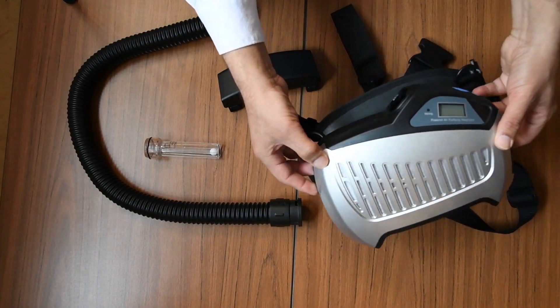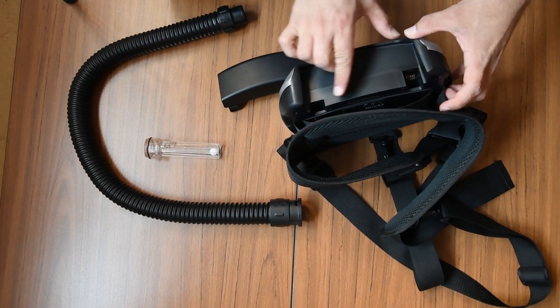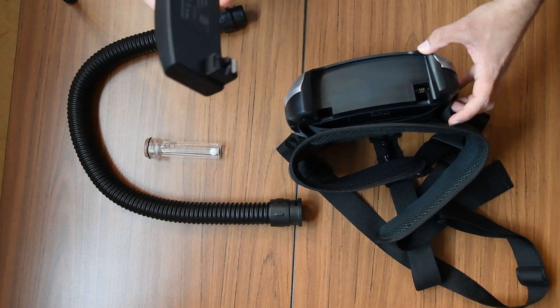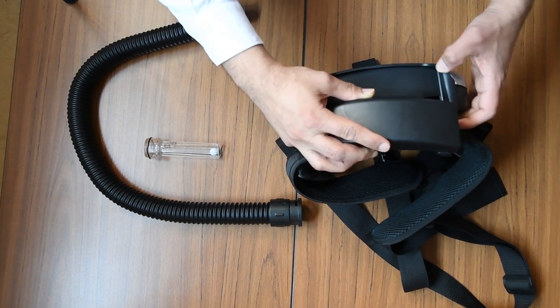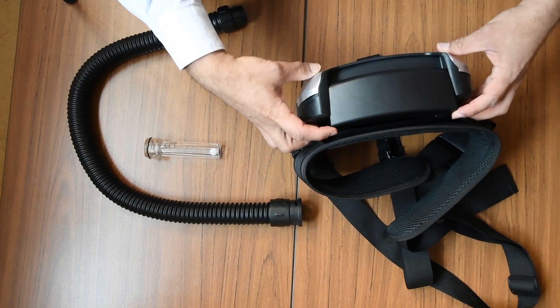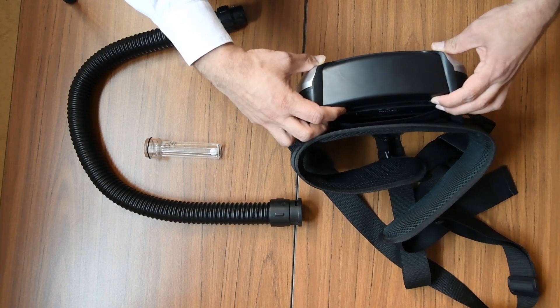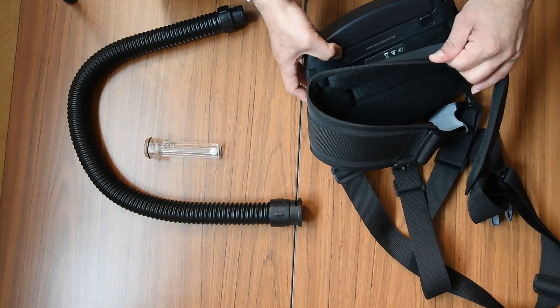This is the respirator and the battery goes in this part. You can see there are slots and the battery slides in just like this, and then you can lock the battery with a little switch here.